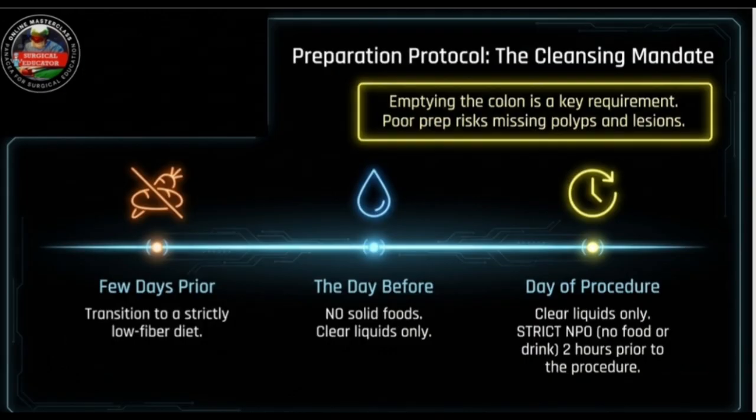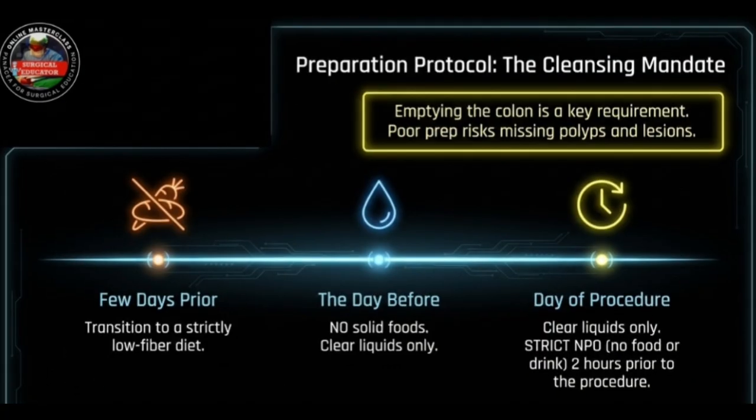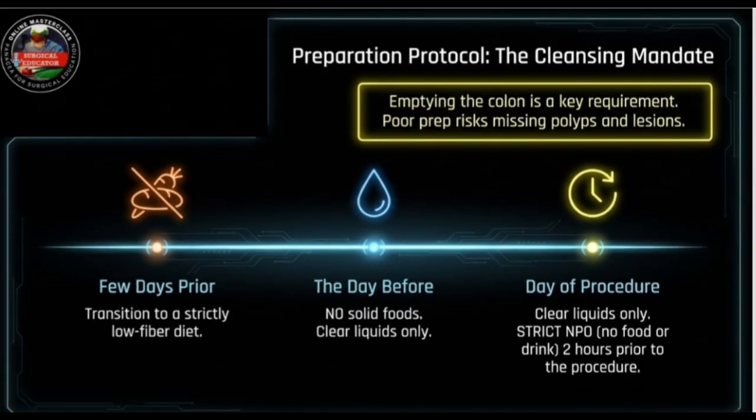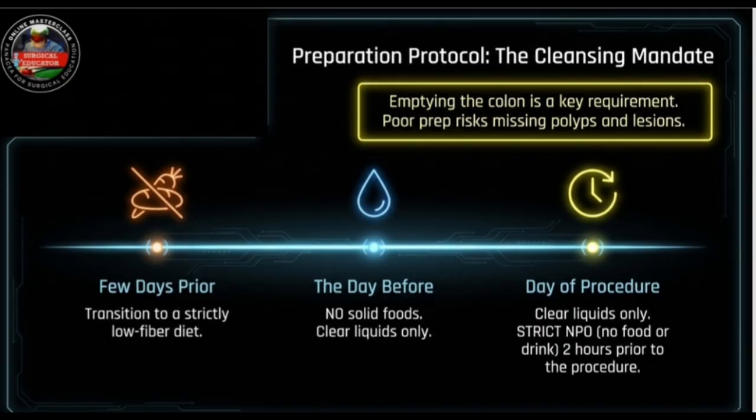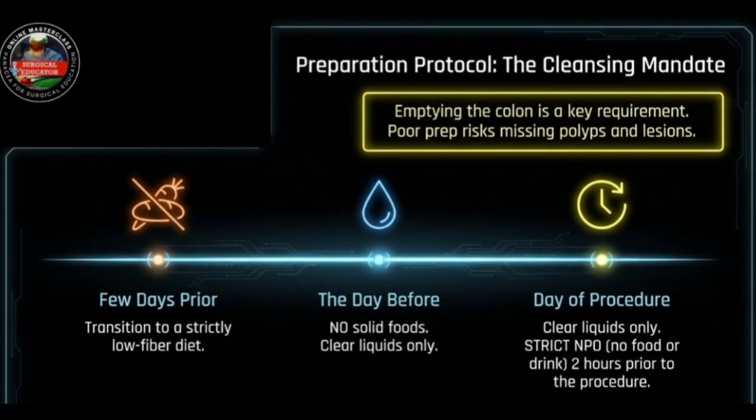The preparation protocol requires a really strict timeline. Patients switch to a low-fiber diet days prior, consume only clear liquids the day before, and adhere to a strict NPO, no food or drink for 2 hours right before the procedure. Why such an aggressive, multi-day wind-down?